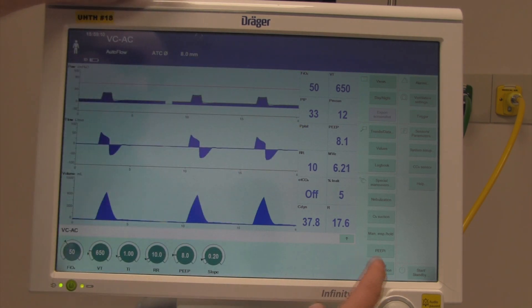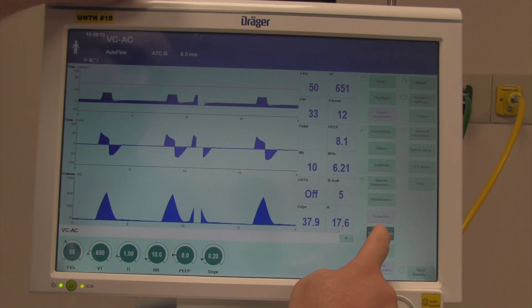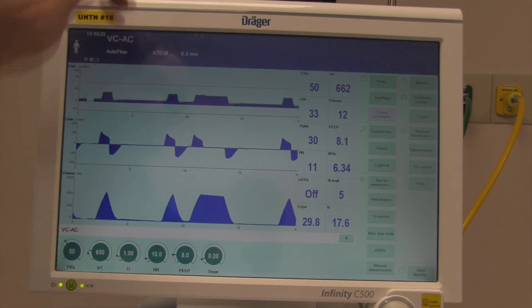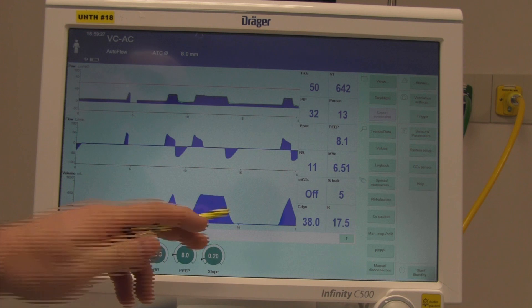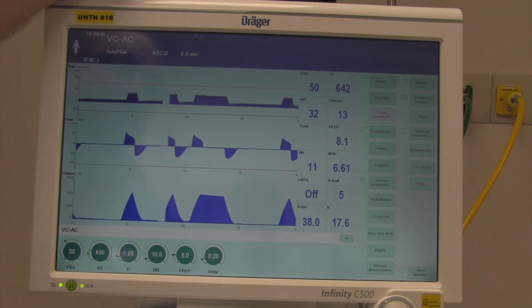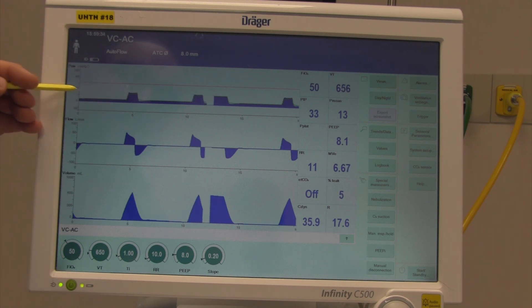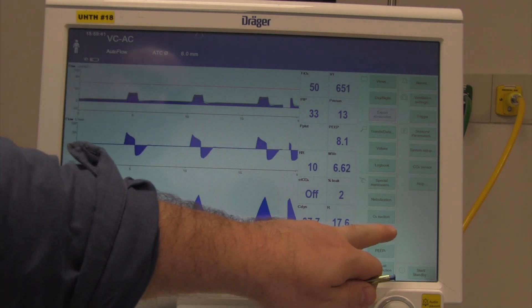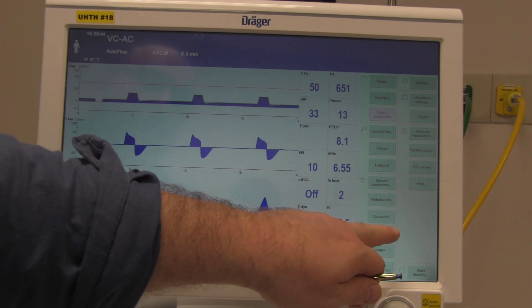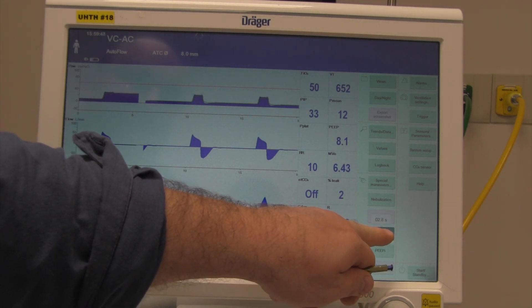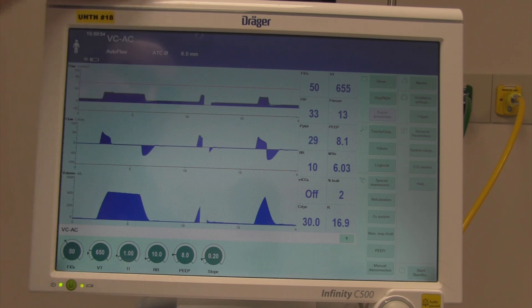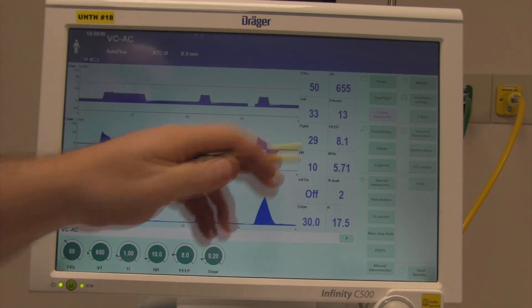Let's do a breath hold again to get a plateau pressure. It needs to be at least two seconds for a good reading. We're reading 30 here. If you've got a leak in your system — you can see a little bit of a leak on the volume waveform — you may not get a pressure reading. In those cases, I have to eyeball it: freeze the waveform and look at the plateau area. If our PIP is 33, the plateau is probably around 30–31.